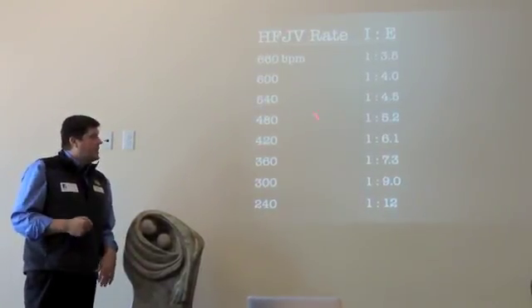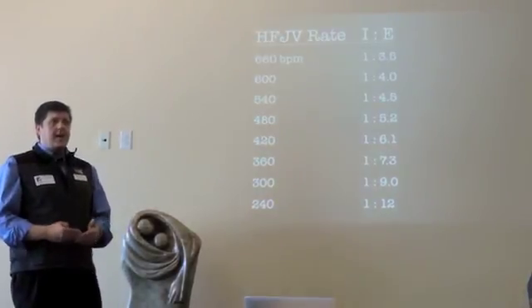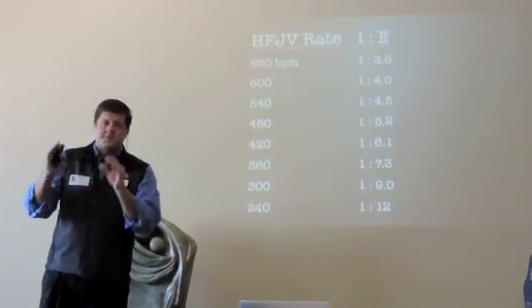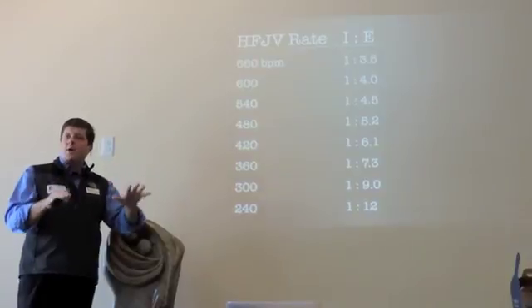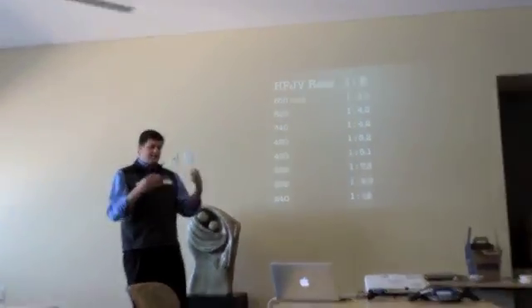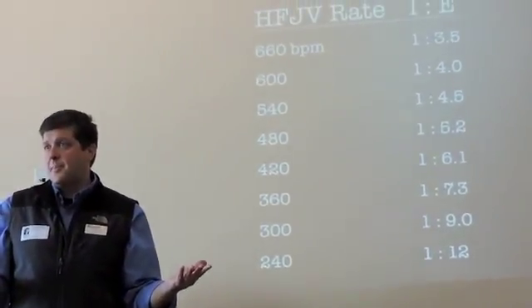So change the rate based on the pathophysiology that you're treating, and it's something that you kind of set and forget. For most kids it's air leak, so set the jet rate low, leave it alone, let the jet do its job, and then just control your CO2 with your delta P and the jet PIP from there, okay?